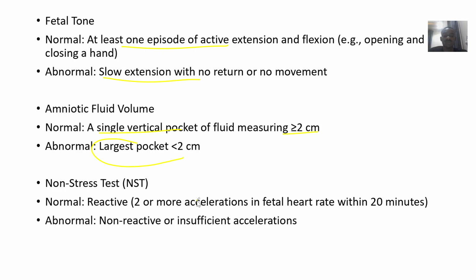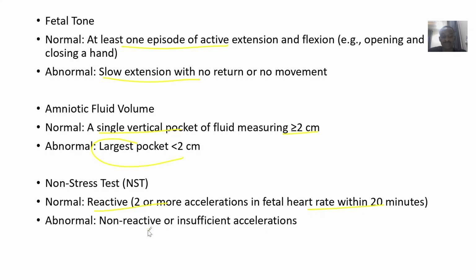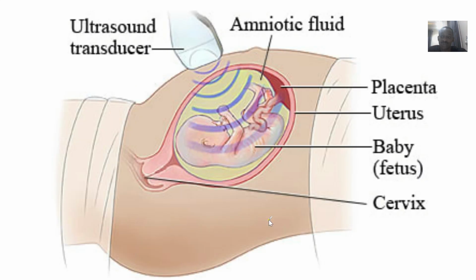Right. So the non-stress test. All right. Normal is reactive, 2 or more accelerations in the fetal heart rate within 20 minutes. That's when they are trying to check the baby's heart rate and all of that. If it is abnormal, it's non-reactive, with insufficient accelerations within 20 minutes.